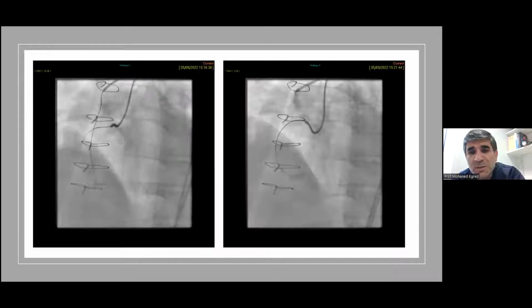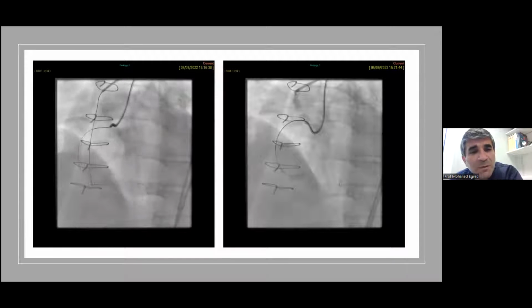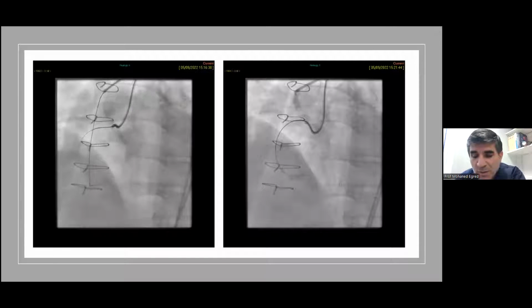And of course, at this stage, it should become like a normal angioplasty. I was expecting difficulties because of the heavy calcification and the inability to deliver the microcatheter forward, because the plan was to deliver the microcatheter, exchange for a RotaWire and rotablate. So what we needed to do, because I did not want to lose my position, is to create a channel to be able to deliver the microcatheter and the rotablation wire.